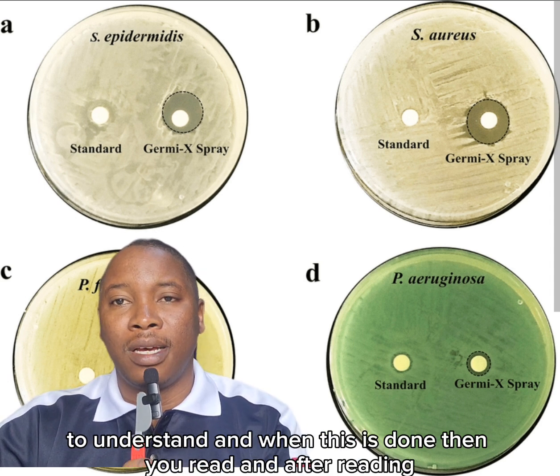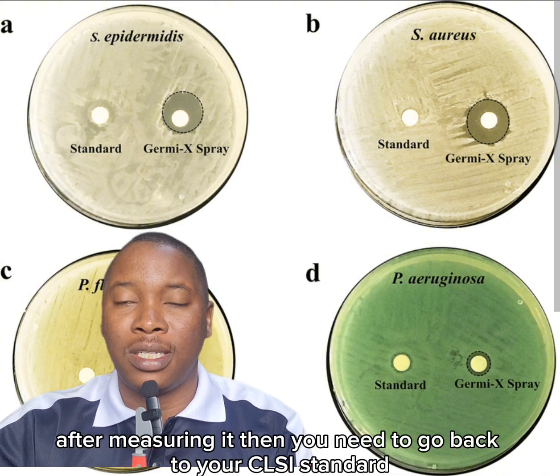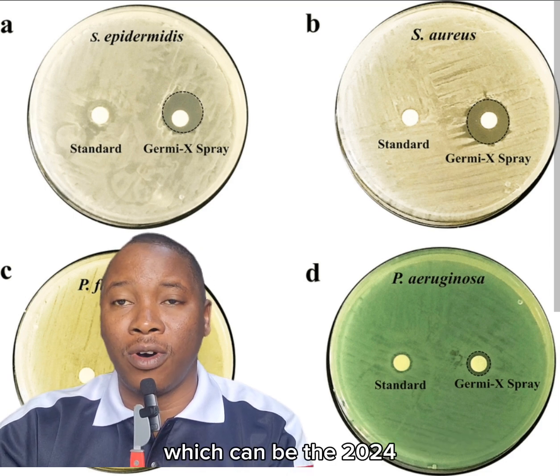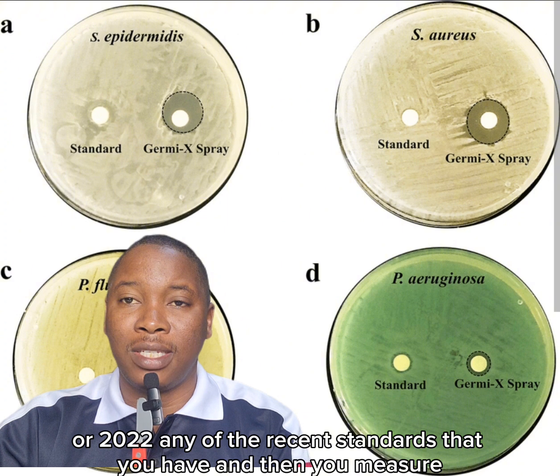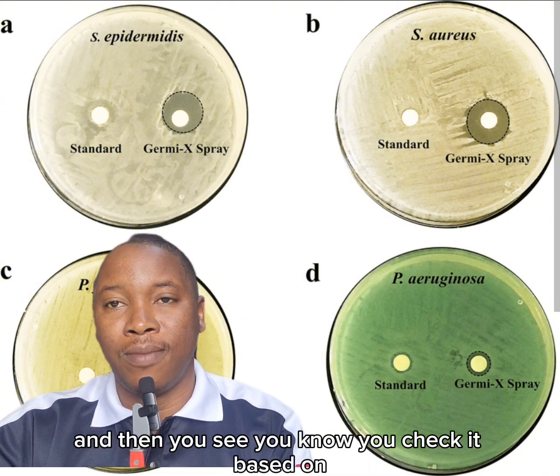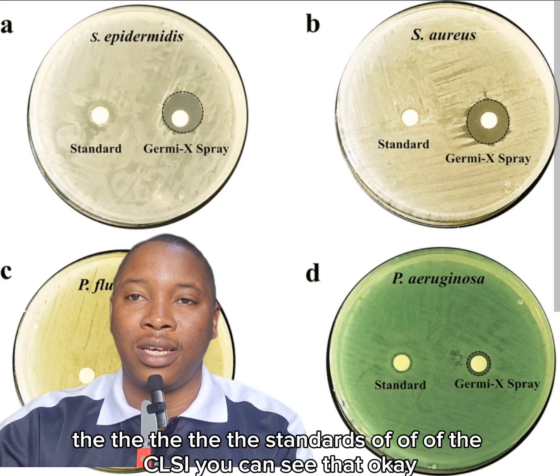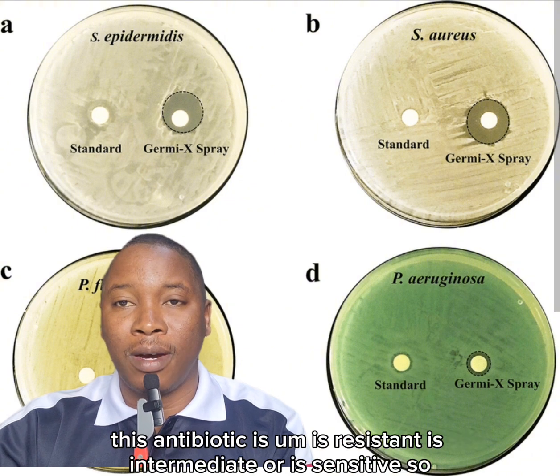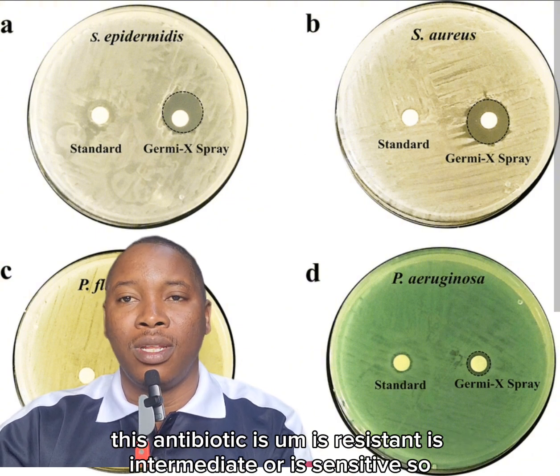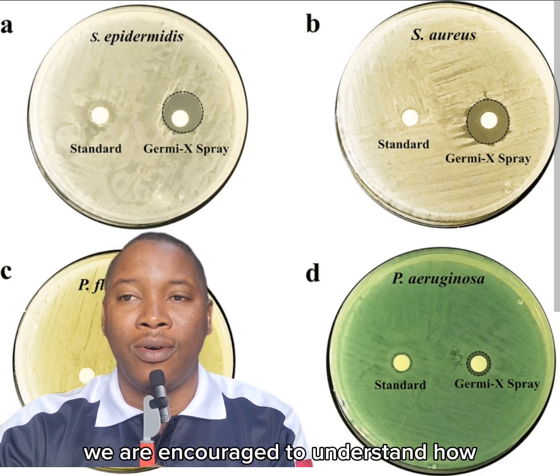And after reading, you use your ruler and measure those zones of clearance. After measuring, then you need to go back to your CLSI standard, which can be the 2024 or 2022, any of the recent standards that you have. And then you check it based on the standards of the CLSI. You can see that, okay, this antibiotic is resistant, is intermediate, or is sensitive. So this is very important and is a test that we're encouraged to understand, how it is done and how we do it.